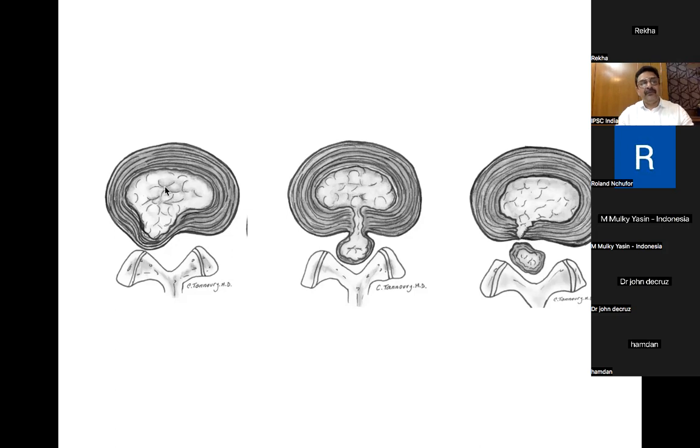So the first thing a lot of people ask, and I was expecting that somebody would ask this, is: once the annulus is intact, why would we want to go for the endoscopic approach in this patient? They are making a hole in the annulus. But if the fragment is big and compressing the nerve, we have to remove this extruded material, the contained material. We will go for the inside-out technique in this case. Why? Suppose the ideal is that we go inside like this and start extracting from here.